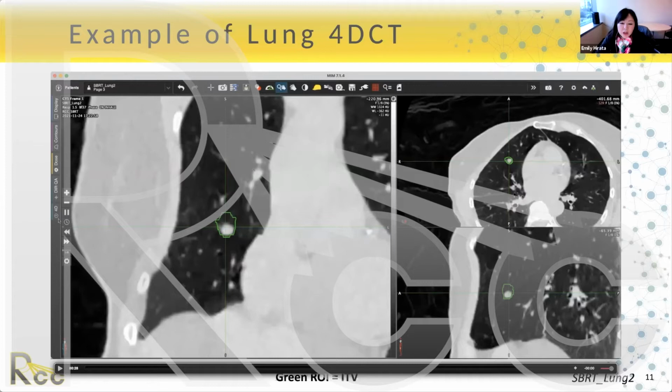One thing I want to share is that tumors don't just move in lines. They sometimes can move like this. They can move anteroposterior. They can move laterally a little bit. So for centers that maybe don't have 4D CT capability, you can do an inspiration acquisition and an exhalation acquisition, and sum the two scans or make a composite scan of that. And that'll get you close.